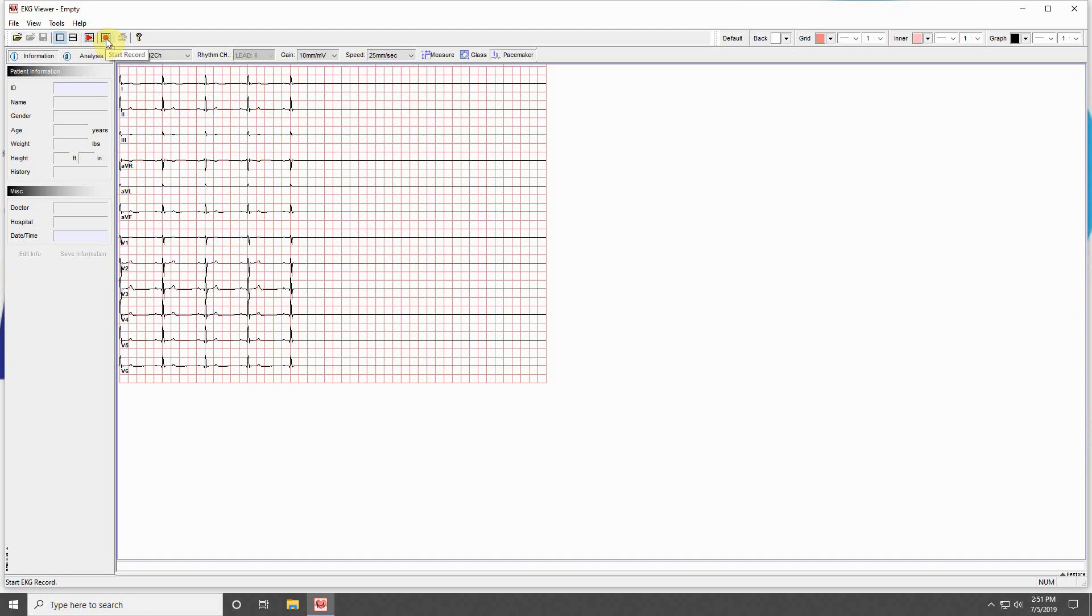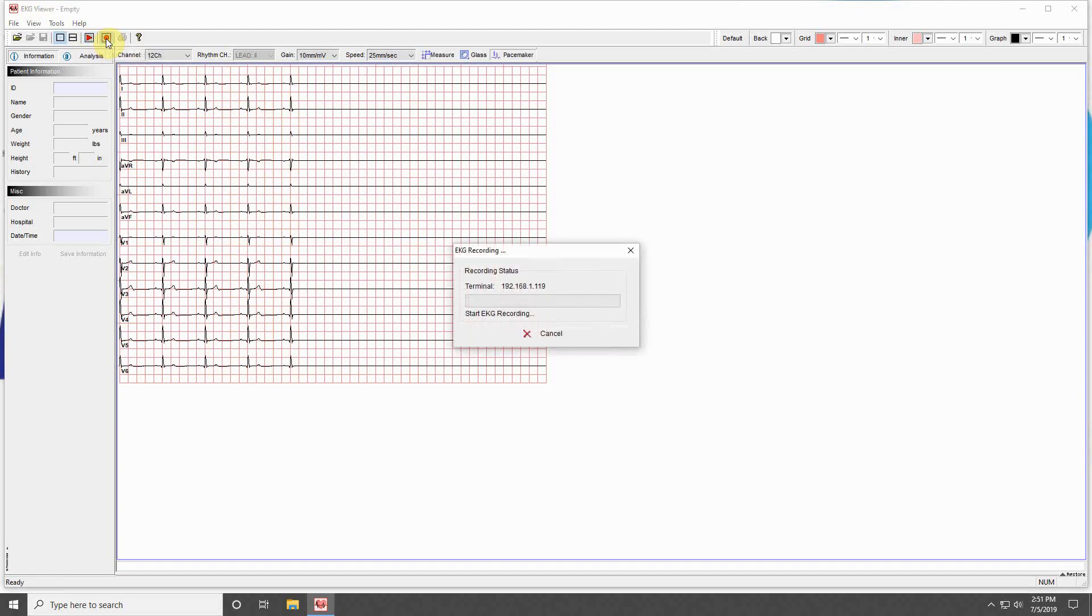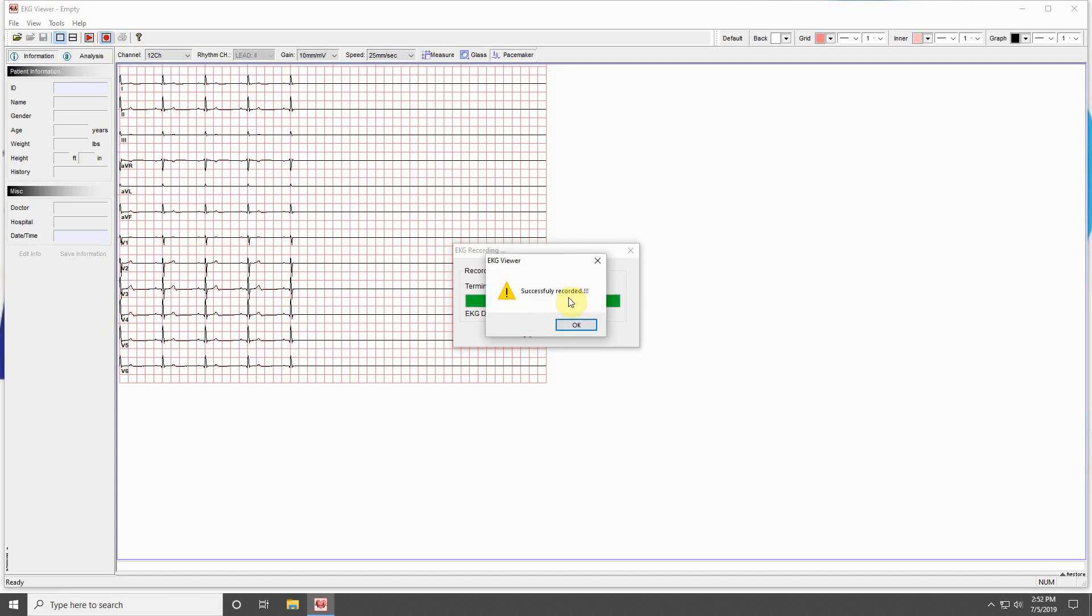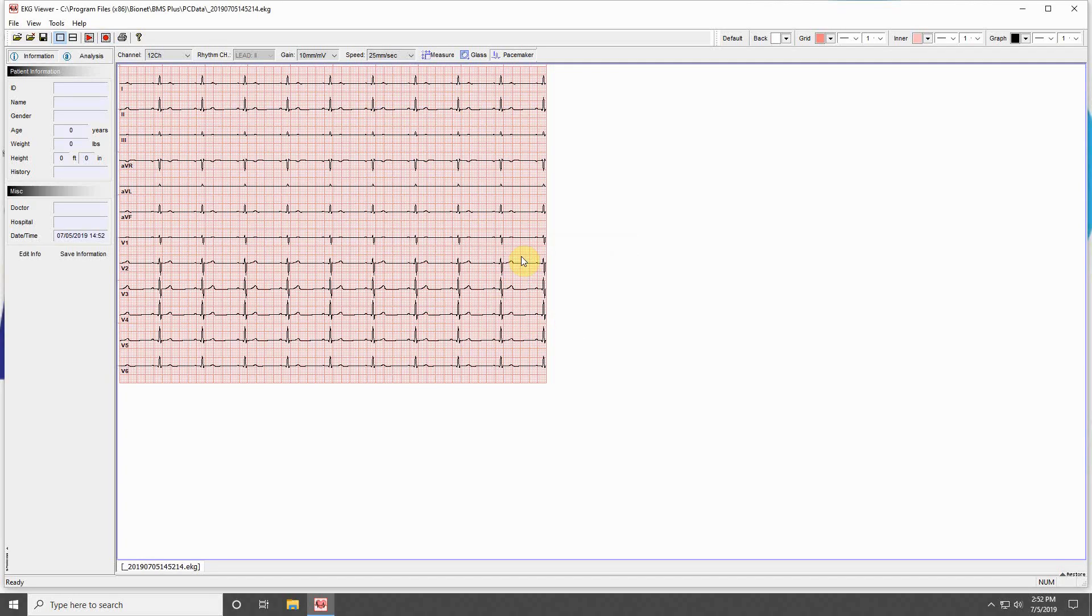The red circle next to this allows you to record a 10-second reading from your connected machine. Once the reading is complete, a success message will appear, and your recording will be on the screen. Once your recording is complete, it will be saved in the folder location you determined in the settings menu.